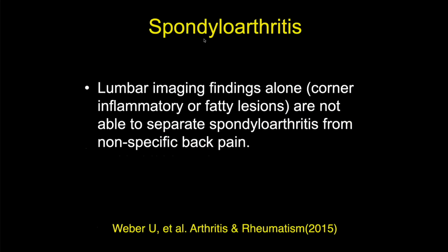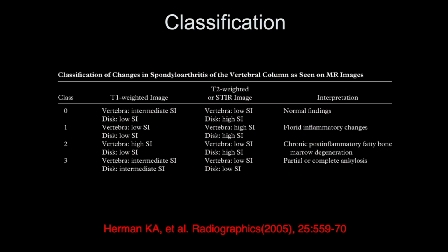So as we'll see, a lot of these findings are not specific for spondyloarthritis, so you'll need to put it in the context of the clinical syndrome and other imaging findings which we see.